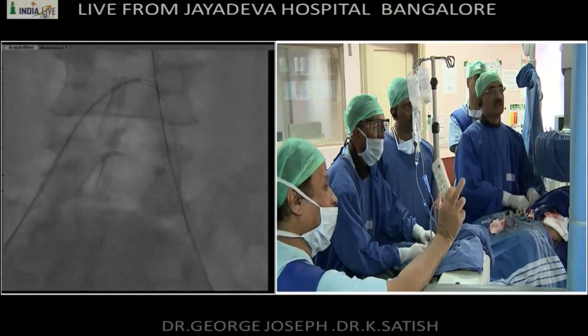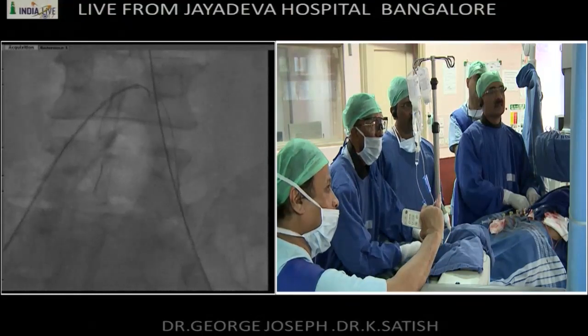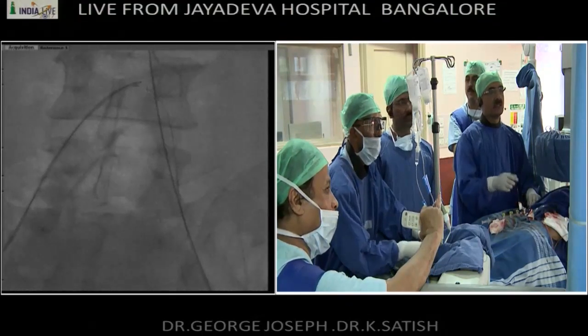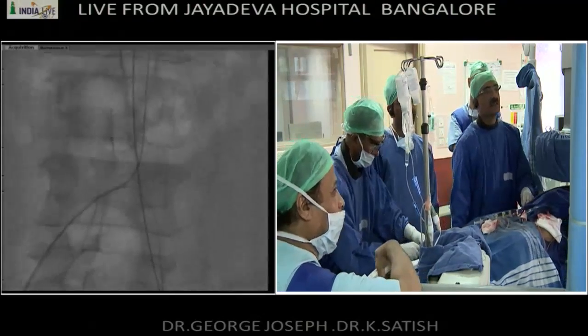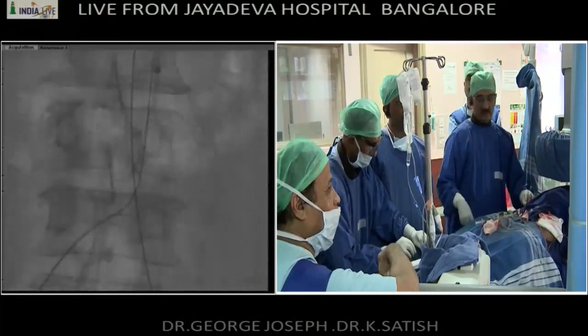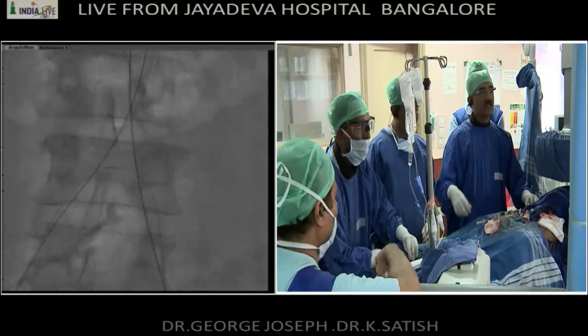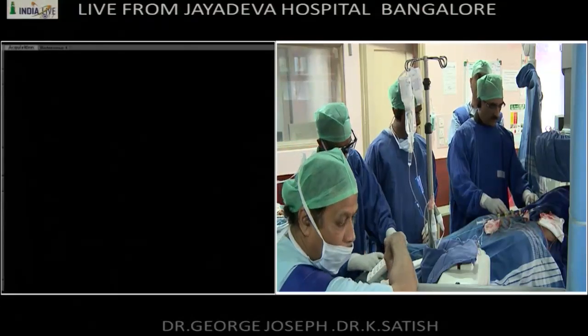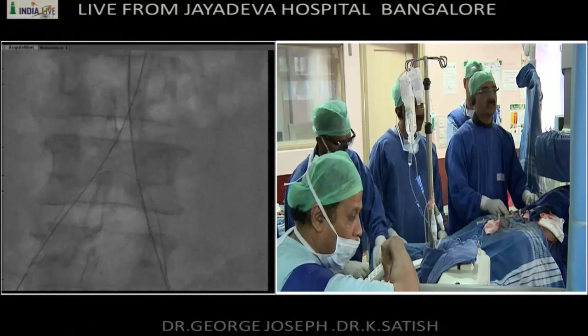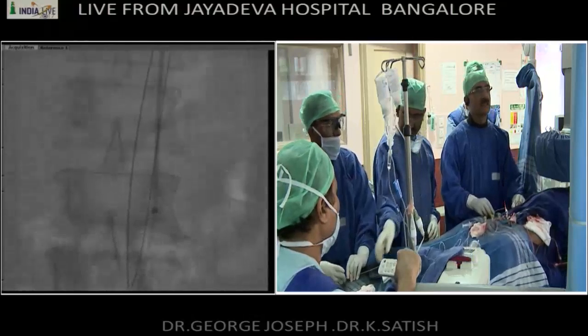Can you show that there? I'm trying to go up there. Can you pull the wire back and try to go up? Okay. So now both the wires are up, and take it up nicely. Yeah, show the top end. I just want to make sure we've got enough on that side.